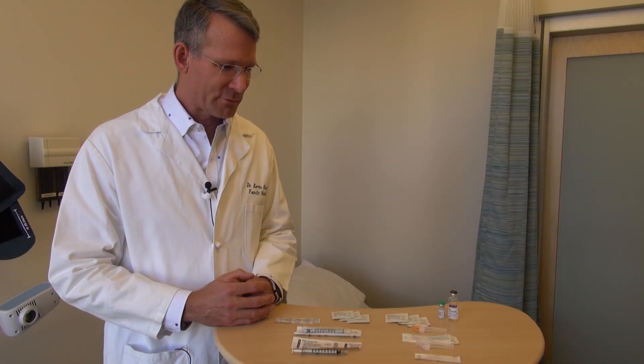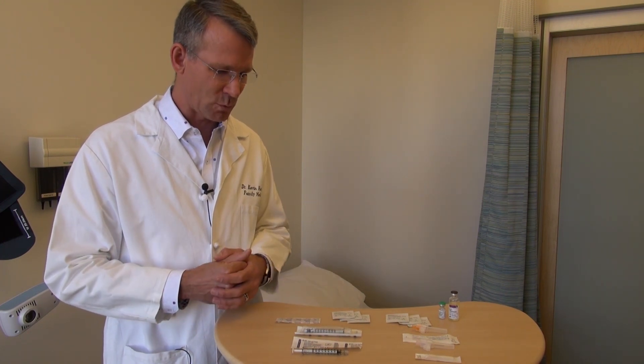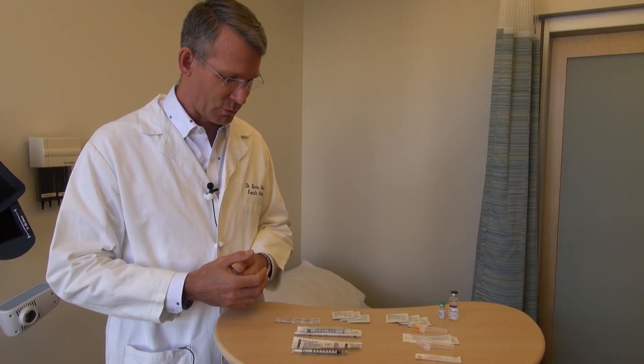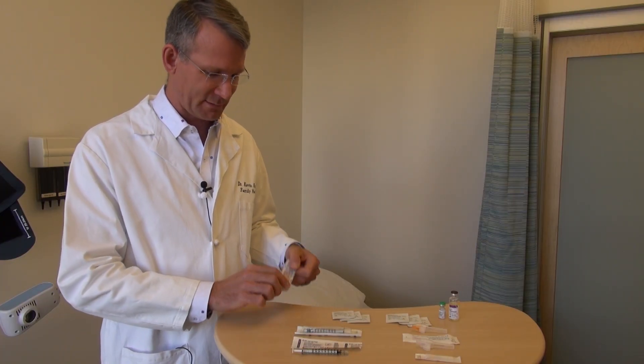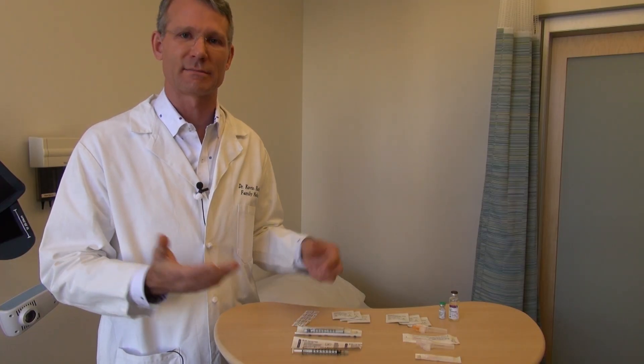Here we're going to talk about the different supplies you need to do an injection at home. I've laid everything out on the table and we'll describe what's here and the logic behind why we're choosing what we're choosing. The first thing is a band-aid — you'll need that after you're done. Sometimes you'll have a little bit of bleeding, sometimes you won't, but it's always nice to have a band-aid close by.